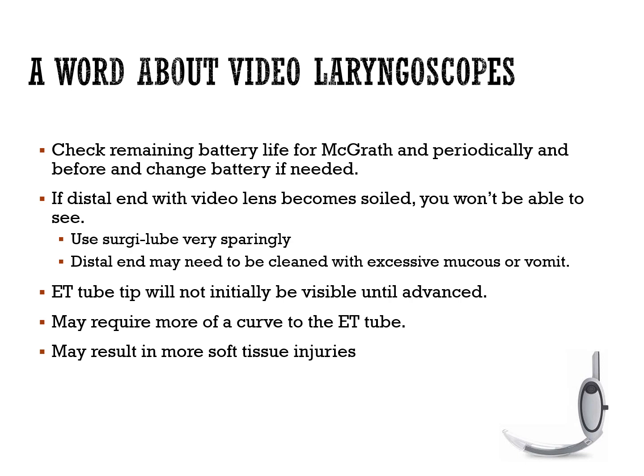Once you're done with first rounds, you go around checking various things, making sure there's an Ambu bag in every room and two oxygen flow meters in every room. You're also checking the video laryngoscopes to make sure the battery, since we use a lot of McGraths, has a minimum of 20 to 25 minutes. It's not going to take you that long to intubate, but in case somebody turns it on and leaves it on before you're ready to intubate, you don't want to have 5 minutes left on it. You don't want to be that person who's ready to intubate and the battery just goes dead on you.